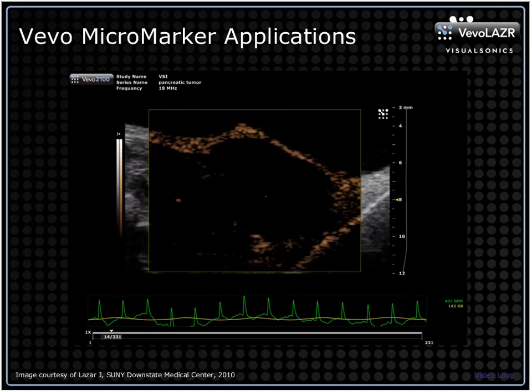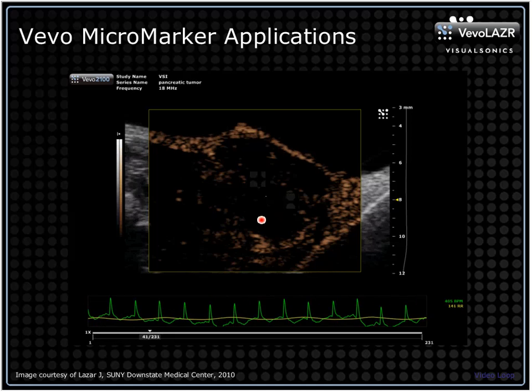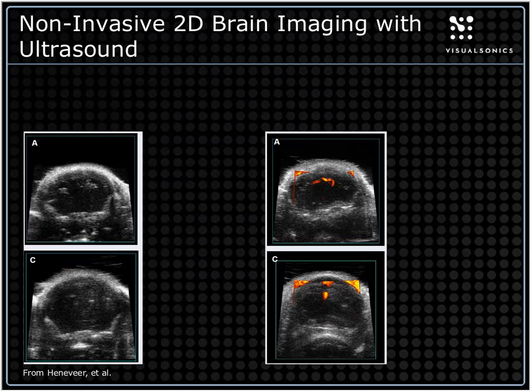This is a good example of using not just the ultrasound, but also the contrast and the Doppler functionality. So the Doppler, the ability to detect the frequency shifts due to movement, in other words, detect any kind of movement in the image, such as blood flow, using all of these modalities together to learn a bit more about the pathology that we're trying to study.